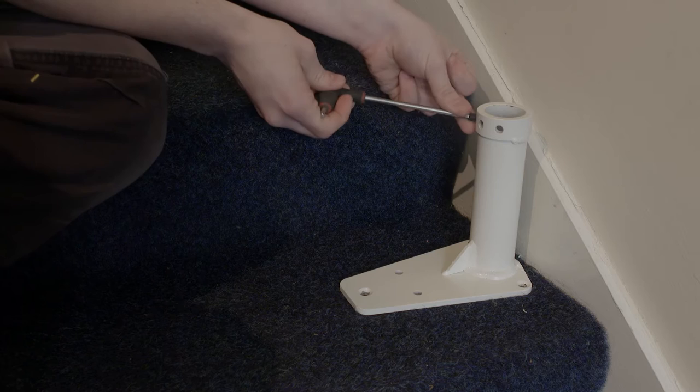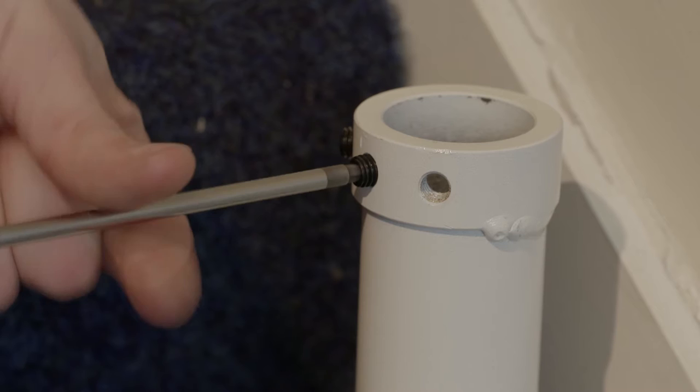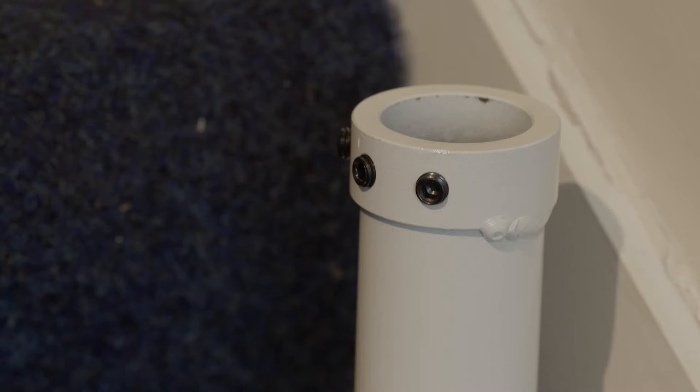Fit the 8mm grub screws to each of the leg bases, making sure they do not project into the inside of the base. Then place the bases in the position shown in the installation drawing.